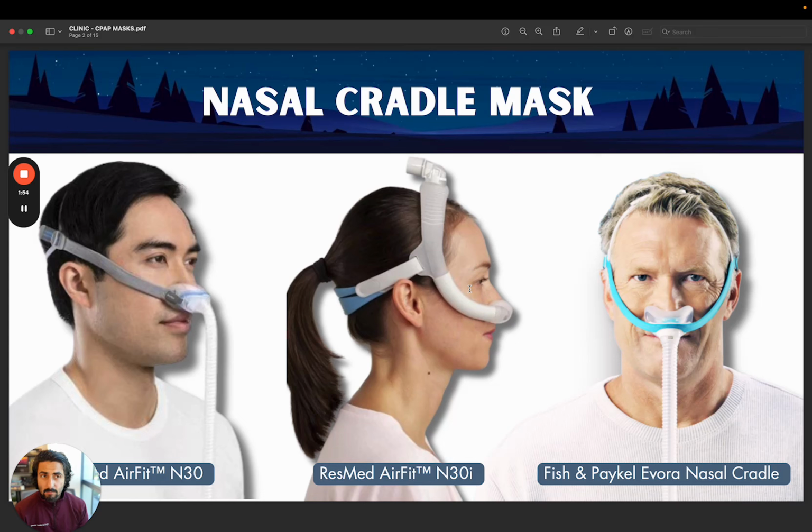Because we want people breathing through their nose as best as we can. I have another video where I talk about mouth breathing versus nasal breathing and how that influences sleep and breathing, and we'll put the link in the notes below. But anyways, first we need to figure out, are you a mouth breather or a nose breather or both? Because nose breathing is better, and it will also be conducive to hopefully using a less obtrusive mask.